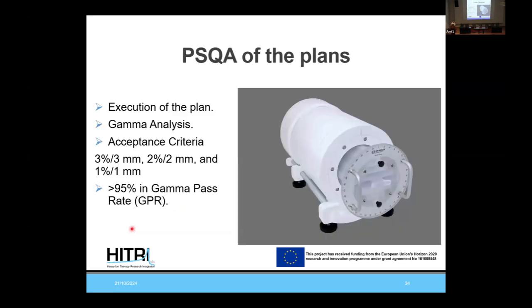After that, okay, we did it on the computer. Great. We are playing, we are changing the beams, we are changing the dose. The crucial point here is the QA. We must test it. So we have here a phantom. For example, this is the last one, don't worry.